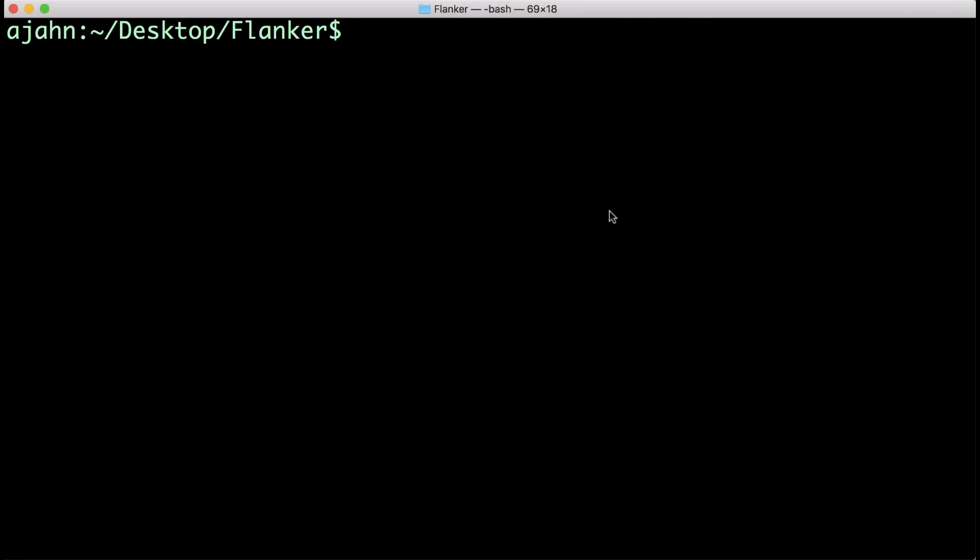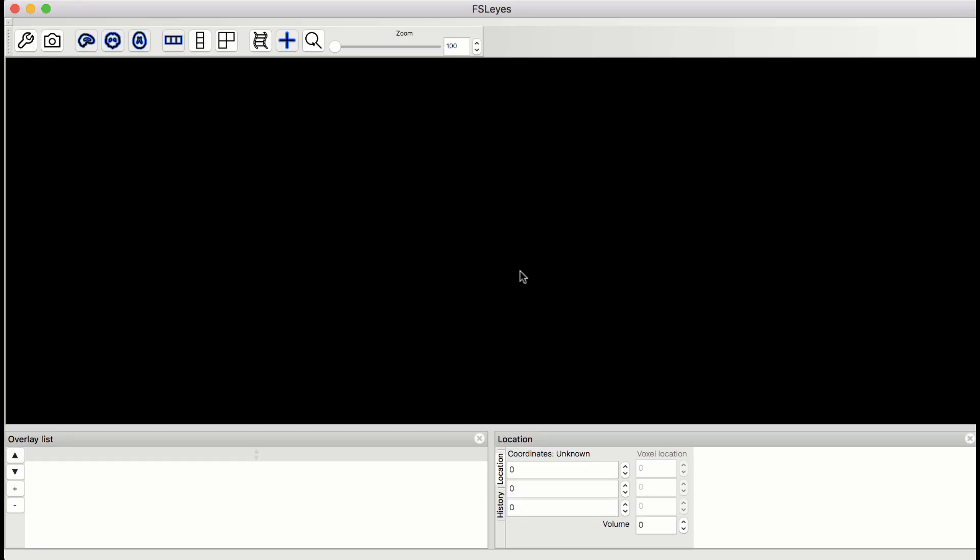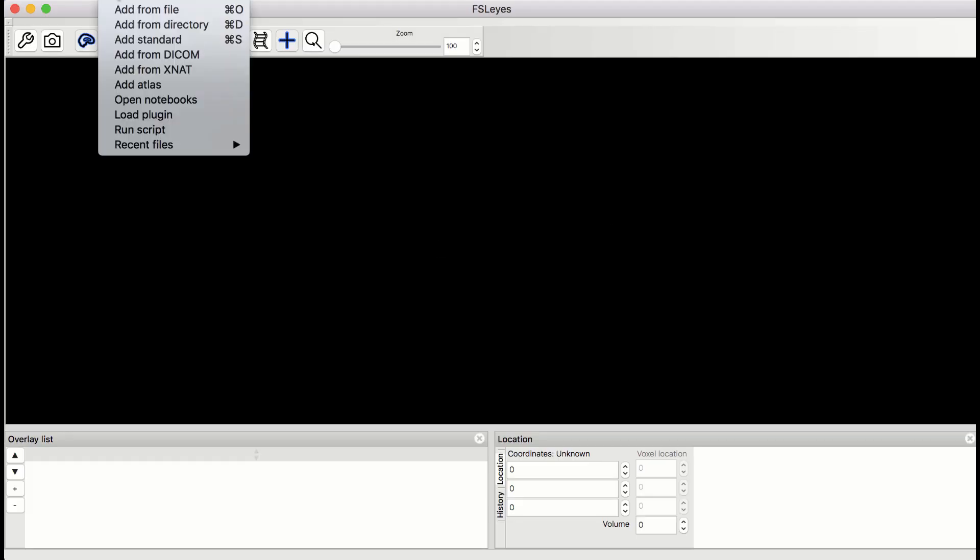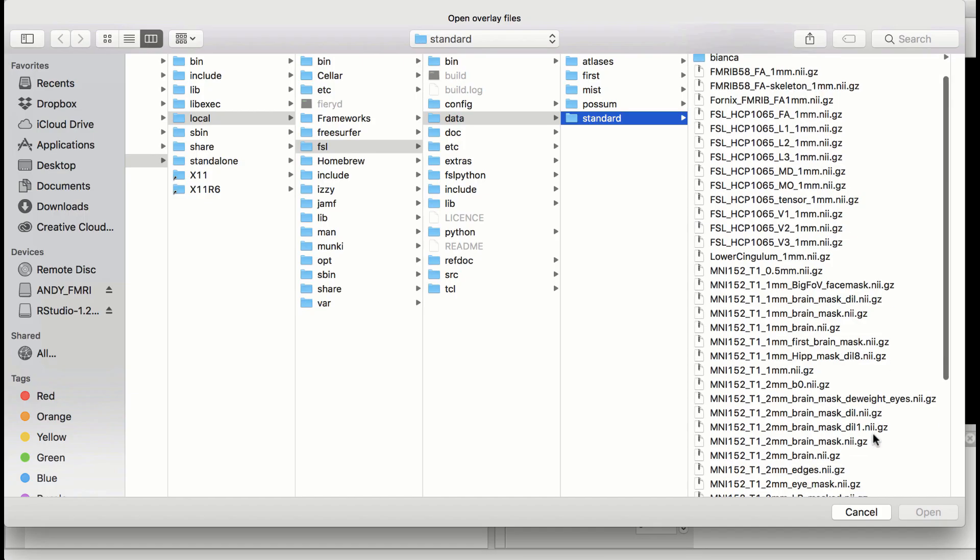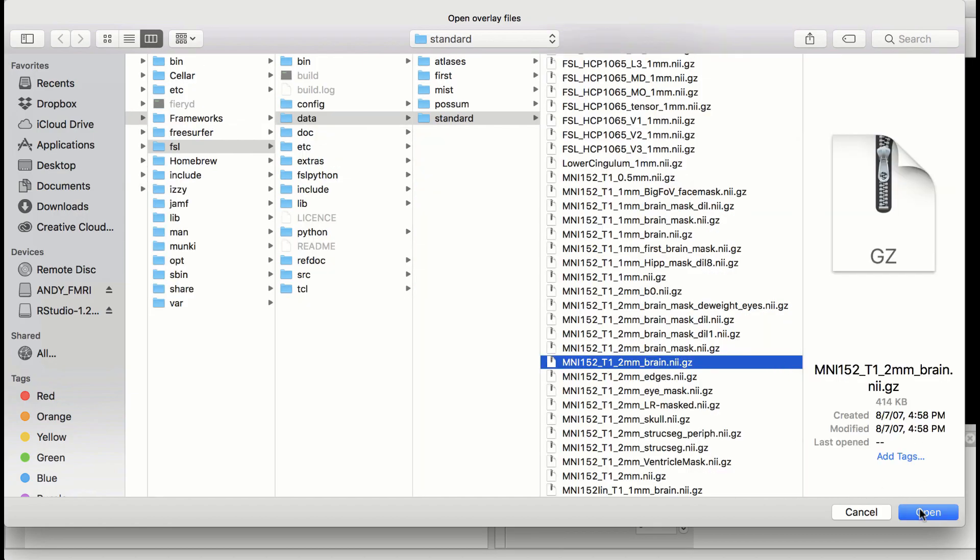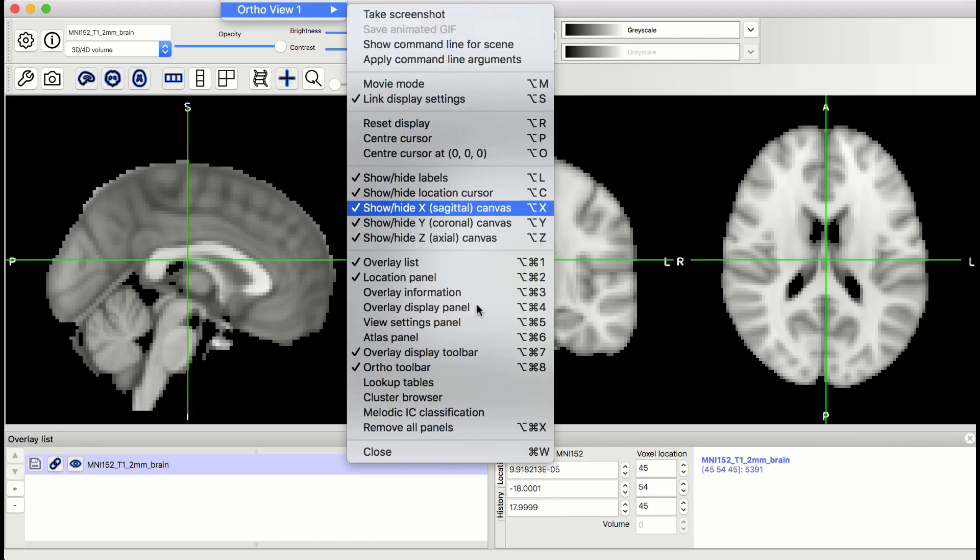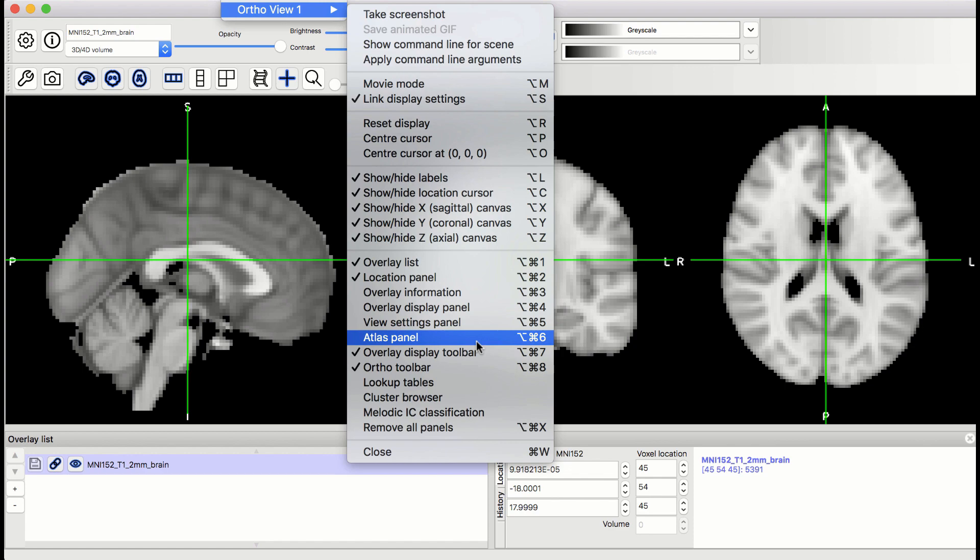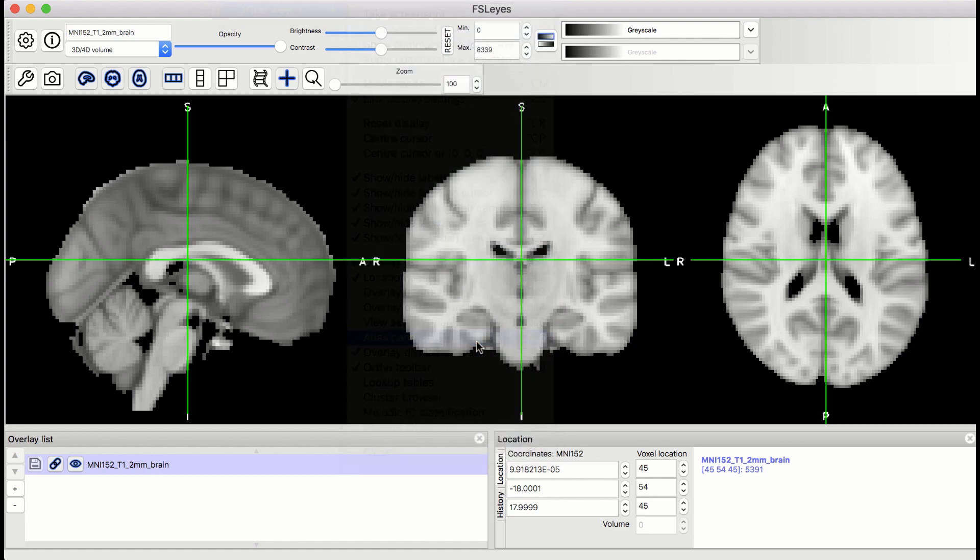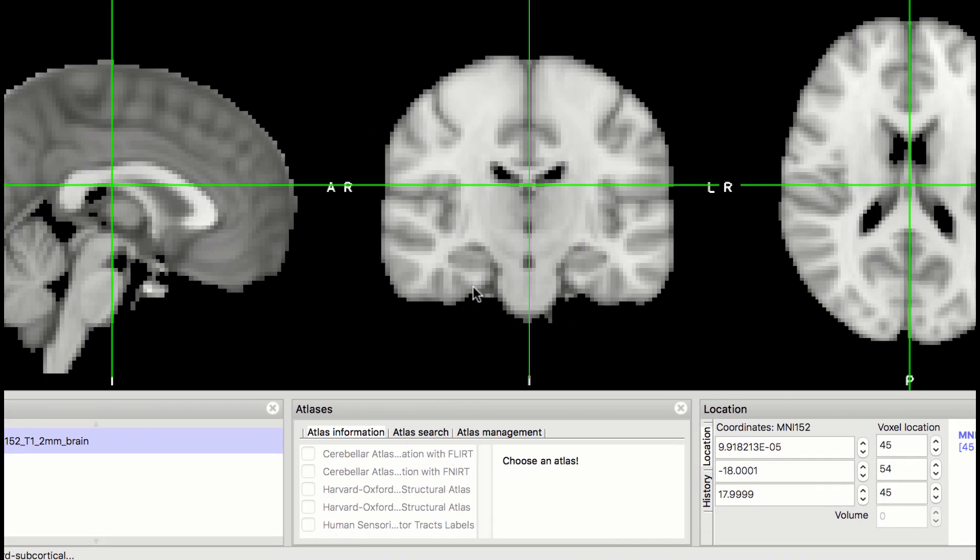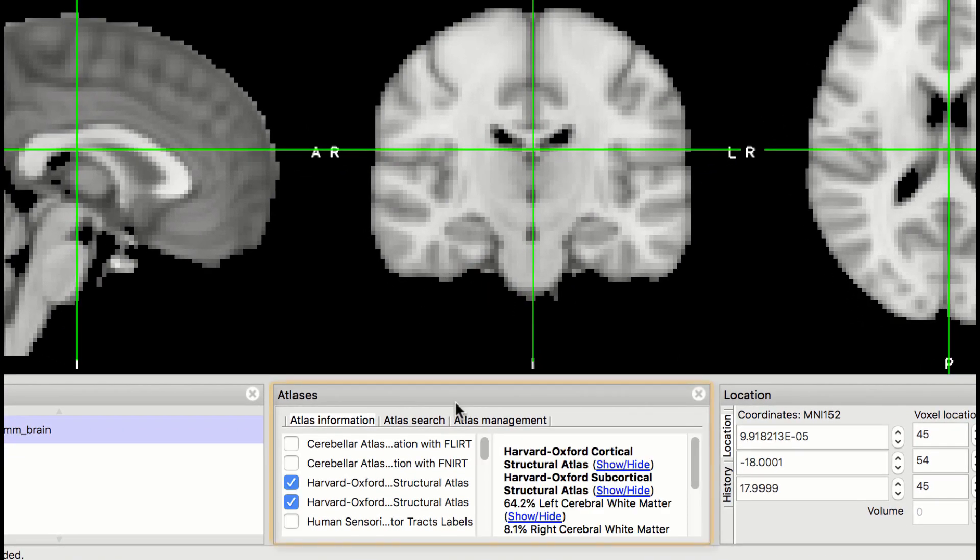FSL has many atlases already installed, which you can access through FSLeyes. First, load the MNI template that you normalized your data to. Then, click on Settings, OrthoView 1, and select the Atlas panel. It will open up a new window called Atlases.